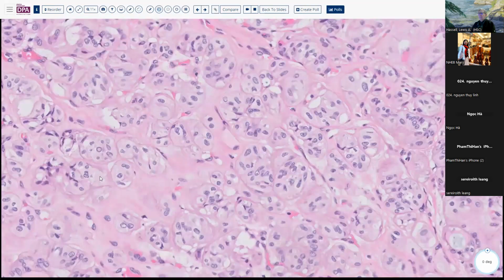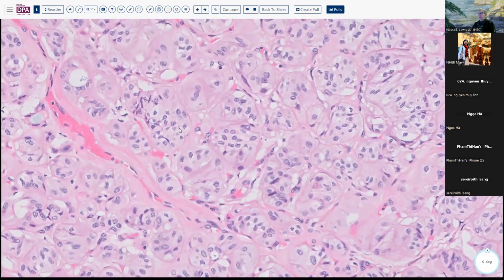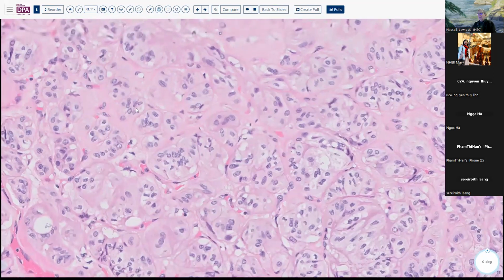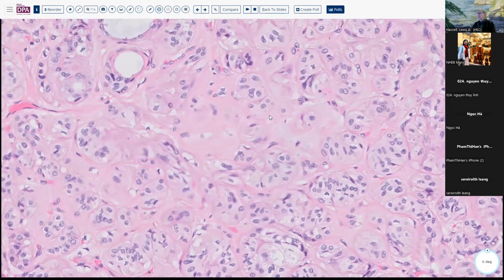It does not have the usual papillary thyroid carcinoma changes. It tends to have a different molecular alteration, which I think is GLIS mutation, if I'm correct. And then, of course, it has these occasional yellow bodies that can be somewhat subtle, but are definitely present in this tumor.